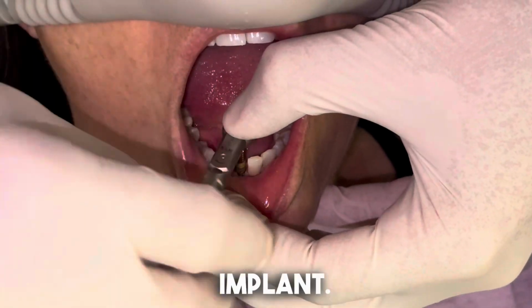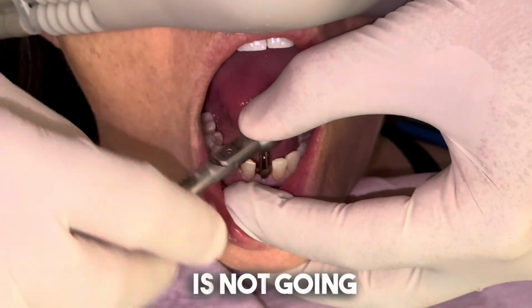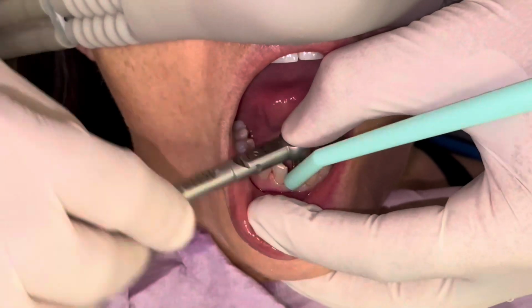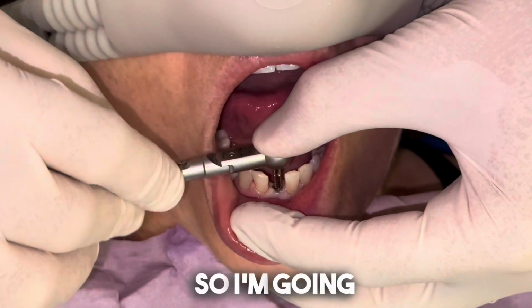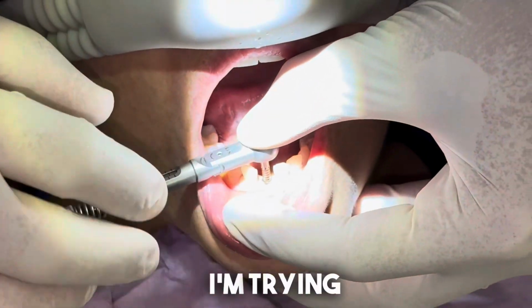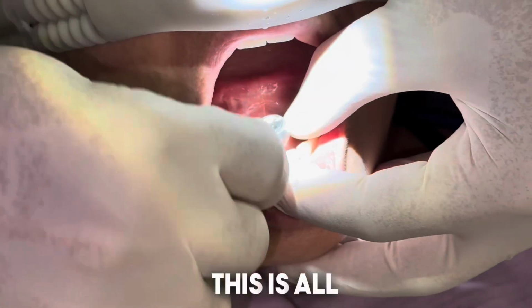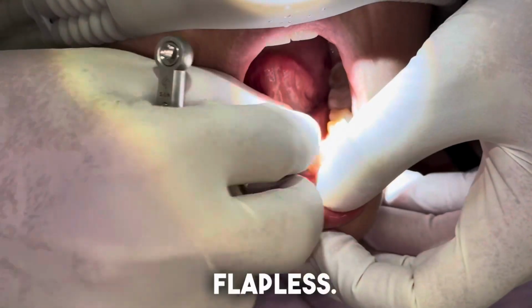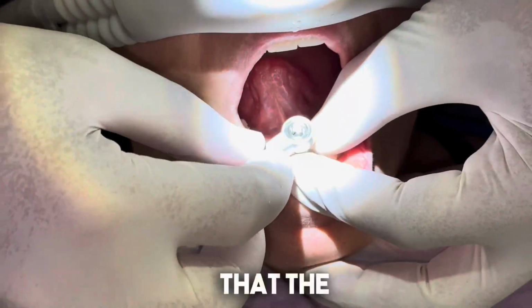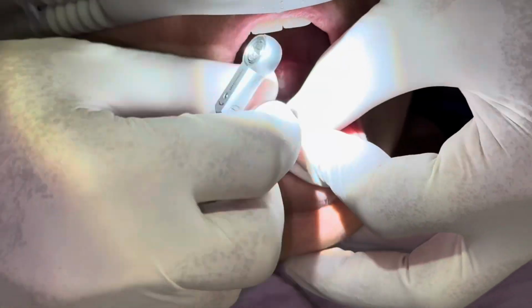Now I'm placing the implant. So here's a surprise. The implant is not going in the way I like to feel the insertion. So I'm going to remove it back and forth, and I'm testing it out, trying to see if the trajectory is good. And again, remember, this is all done flapless. We're not releasing the gums, and I see that the implant has not gone all the way, so I'm going to back it out right now.